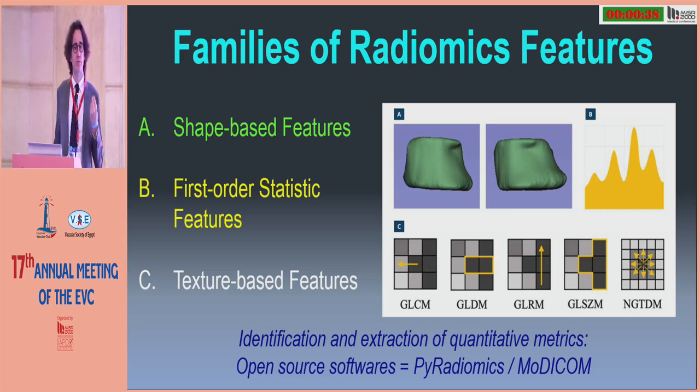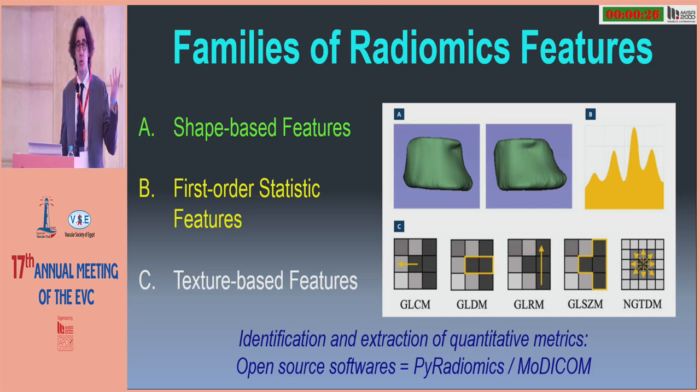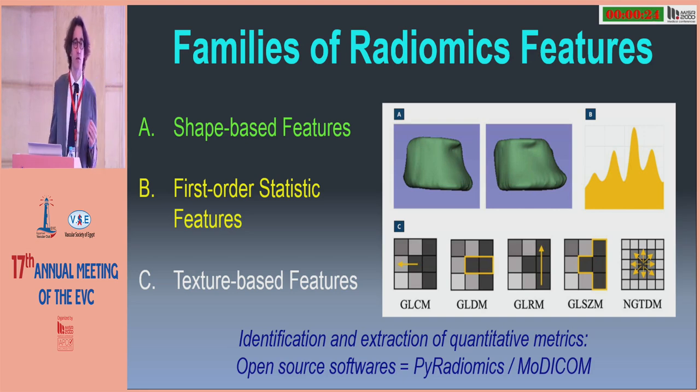Now, we all know, for example, when you look at dissections, true lumen, false lumen, we can see clearly the discrepancies between the 2 lumens, and we know that there is a flow effect and so forth. We can look at lumbar arteries for a type 2 endoleak, and we will see the contrast flowing maybe on a late phase, arterial or venous phase, and we will recognize that there is an endoleak.